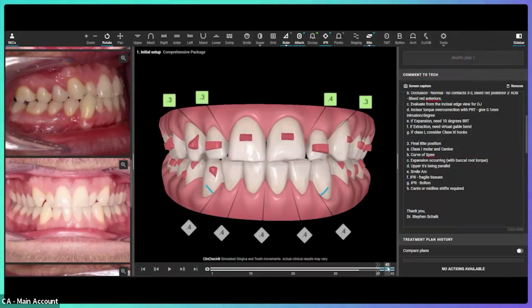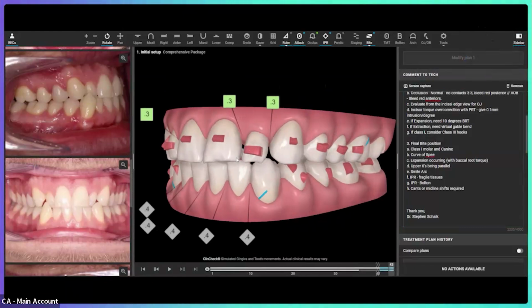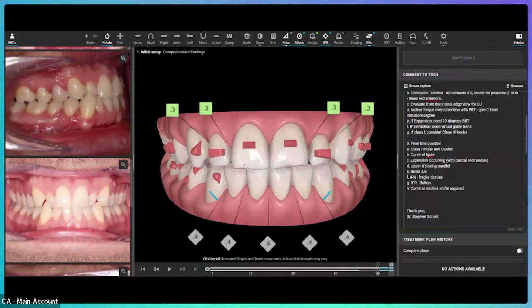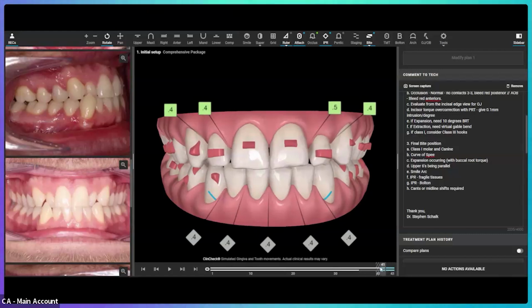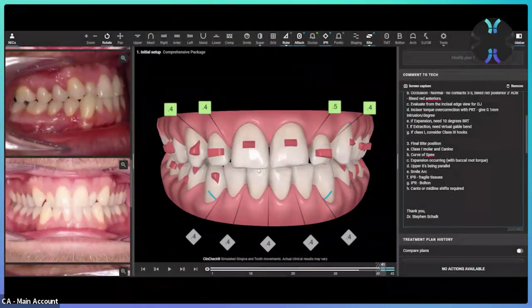If he actually uses these, it's going to force these teeth tighter together, and I will lose the space that I'm trying to intentionally create for restorative, right? That's stupid. Either he wears them and it wrecks things, or he doesn't wear them, and then I've just wasted plastic. So I almost never plan overcorrection with virtual C-chain tightening up the contacts. In reality, I don't use it a lot at all, but I never, ever use it on the first batch of aligners, because we know there's going to be more than one set.